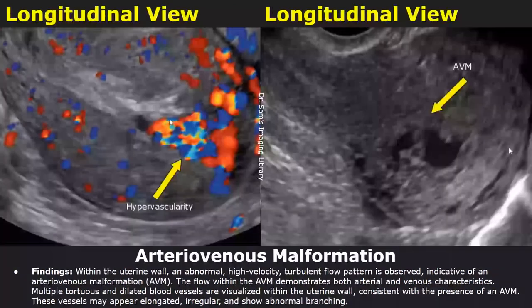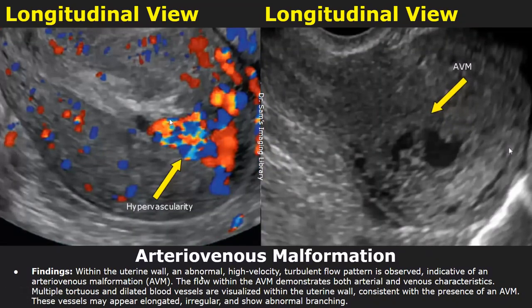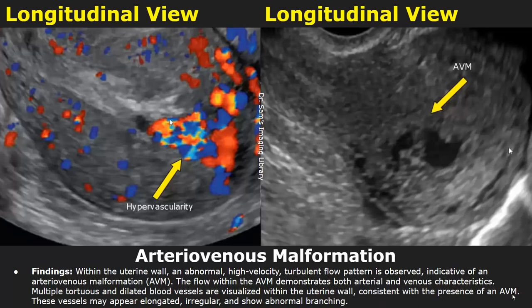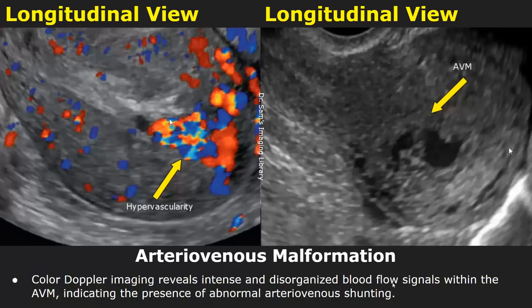Here is a case of arteriovenous malformation. Within the uterine wall, an abnormal high-velocity turbulent flow pattern is observed indicative of an arteriovenous malformation. The flow within the AVM demonstrates both arterial and venous characteristics. Multiple tortuous and dilated blood vessels are visualized within the uterine wall consistent with the presence of an AVM. Color Doppler imaging reveals intense and disorganized blood flow signals within the AVM indicating abnormal arteriovenous shunting.